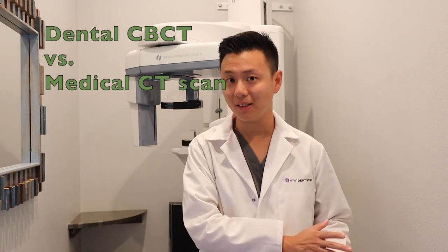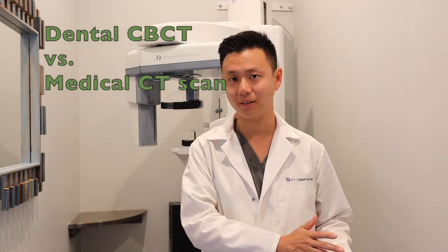There have been some concerns raised in the medical community about the amount of exposure that a patient receives when getting a medical CT scan. However, there are some major differences between a CBCT scan that we use in the dental office and the CT scan that you would receive in a hospital in a traditional medical setting.